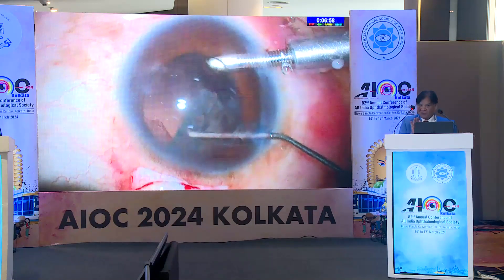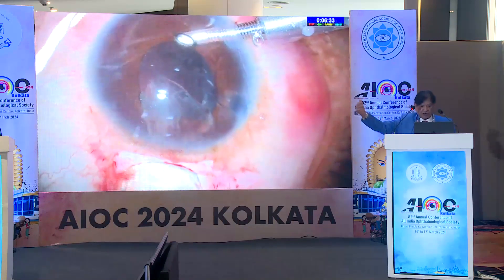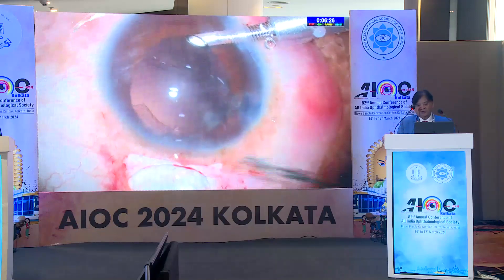Making this incision is an art. Don't make it jagged, don't make it uneven, don't make it too superficial to button-hole, and don't make it too deep to go into the chamber. These are the two things to observe while making this incision. After the nucleus has gone, the anterior chamber maintainer works like an irrigator, and you can use another probe from the side port to remove cortex from everywhere.